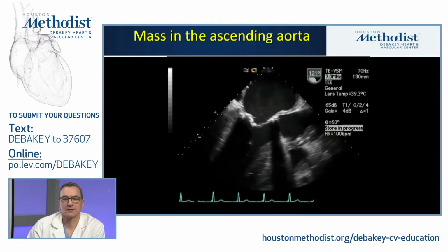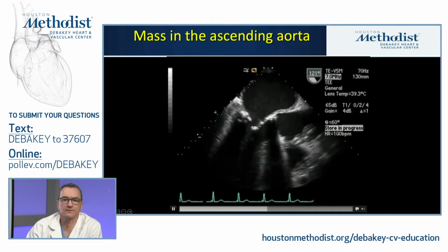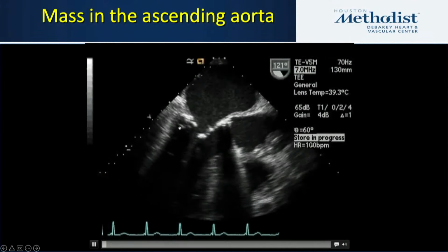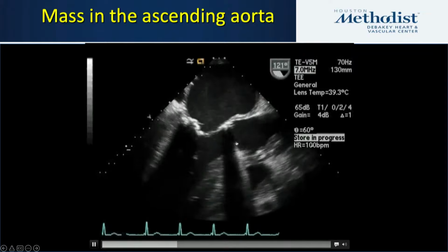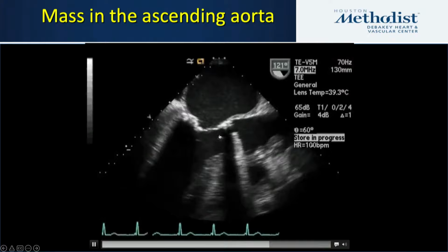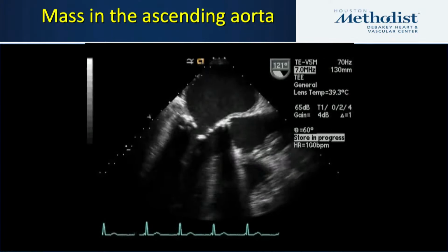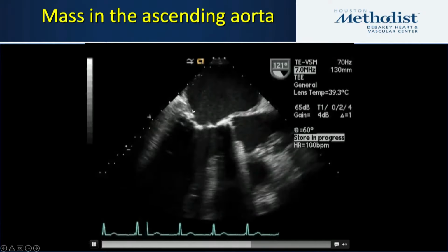So if we look at this particular case, again, a trans-esophageal echo, we tend to focus on the mitral valve, which has a little bit of diffuse thickening, but no specific wiggling vegetations that would meet that oscillation characteristic. We have the prosthetic leaflets moving here, and perhaps they don't look obviously abnormal. Often with prosthetic valves, one of the main challenges is the shadow that's created by the material of the prosthesis. But always remember not to look exclusively at the valves.